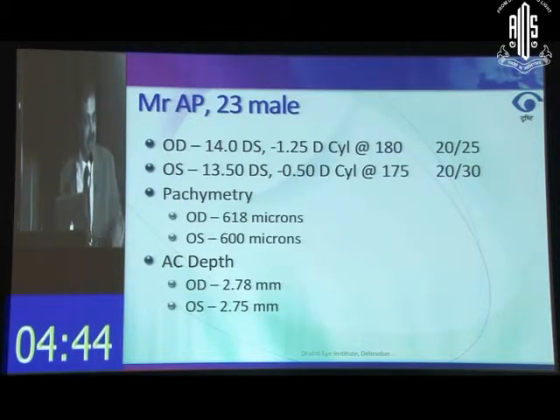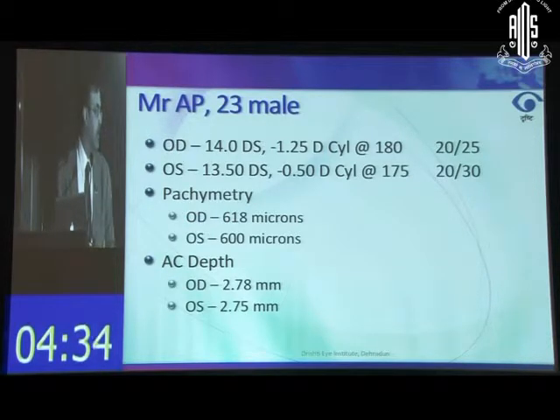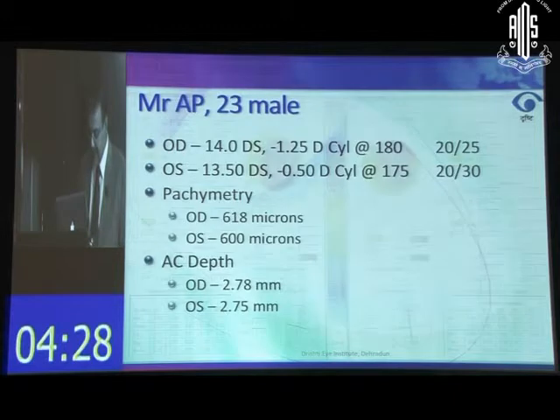That's exactly why this case has been put up, because can we go around ablating 15, 16 diopters? No, I feel the quality of the vision drops down when you make the cornea more oblate. So it's largely safest not to go beyond 10 or 11. So anybody? Okay, let's go back. I'll just go to that previous slide.